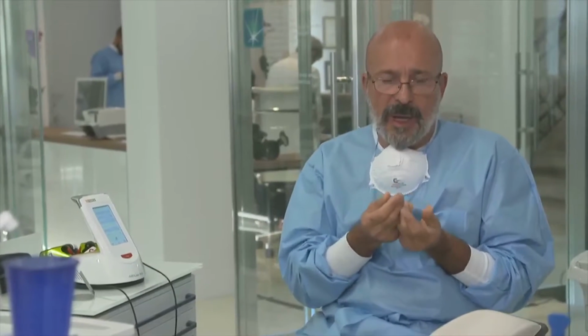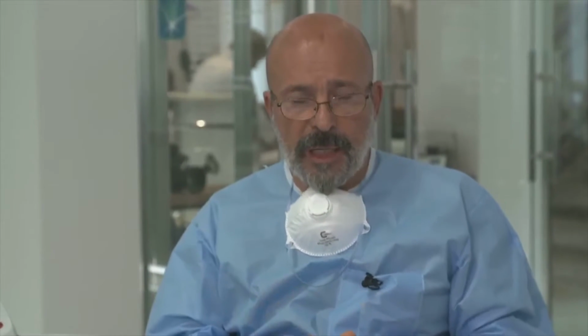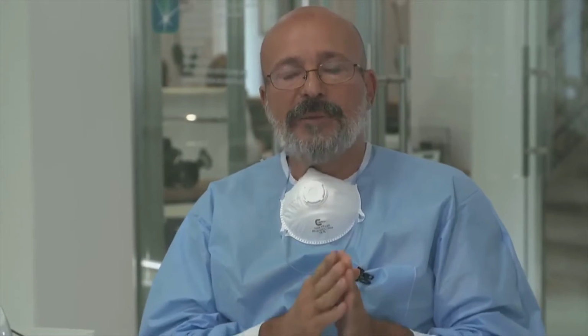If you have some black debris, you have to understand that it means carbonization, too much temperature. We have carbonization when we increase the temperature by 250 Celsius degrees. Too much. We do not want to see a black result at all. We want only to have the cut, the ablation of tissue, the hemostasis, or the other results. But if you see something that is black, it is carbonization debris. So you have to remove it and decrease the power setting.